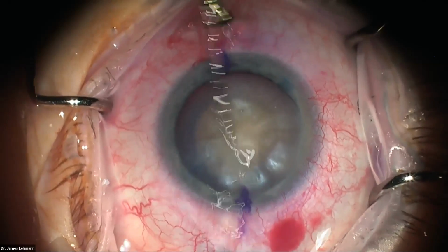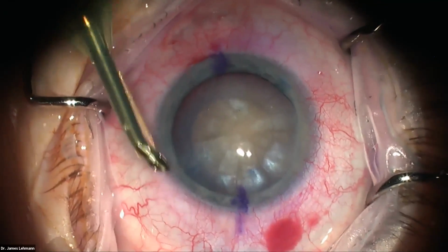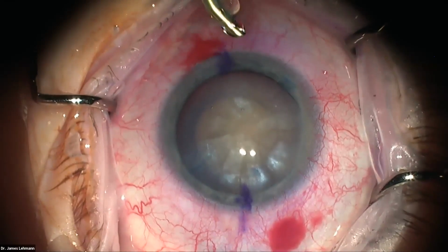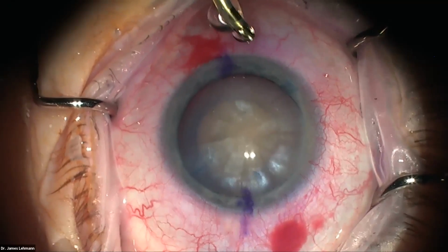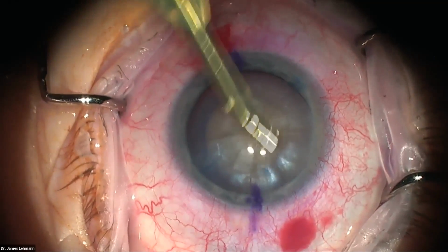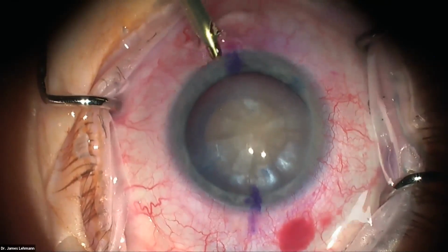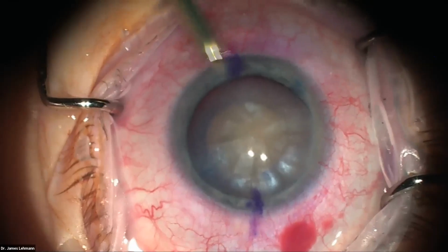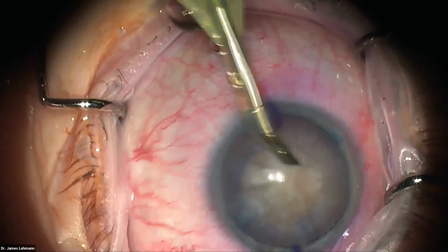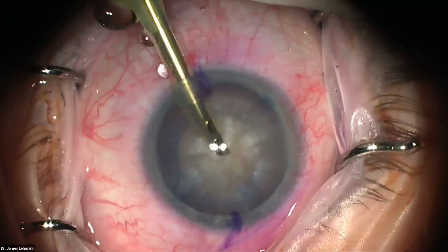So I have the continuous flow, and then you can see again, I didn't talk about it much, but here's the phaco tip. I use a Kelman 45 degree because to me it's the easiest to cut with. There's different kinds of phaco tips. You can have 30 degree, which is better for stop and chop, but you have to talk to your mentors and learn about the different tips and see what works for you. I always put it in upside down so that I don't jab the iris, and then I rotate it 180 degrees.